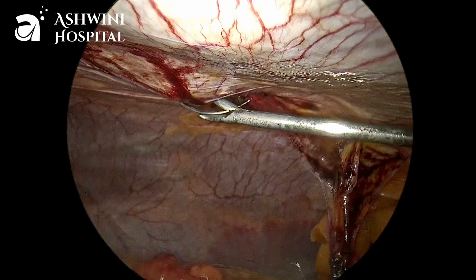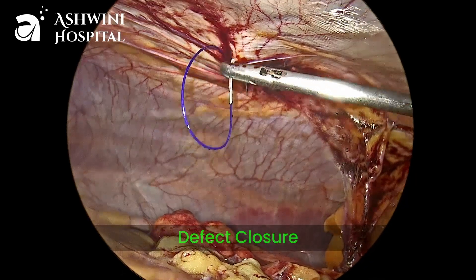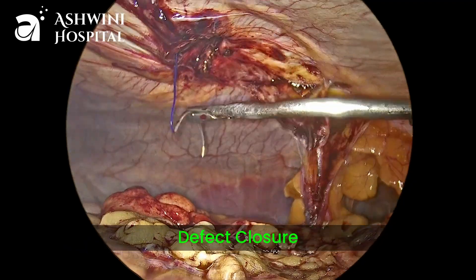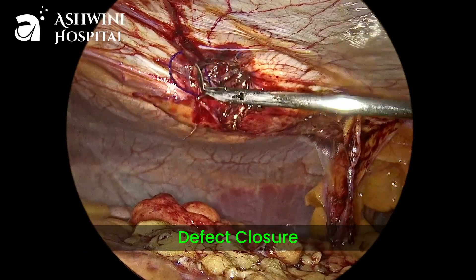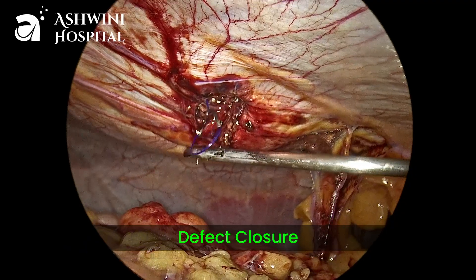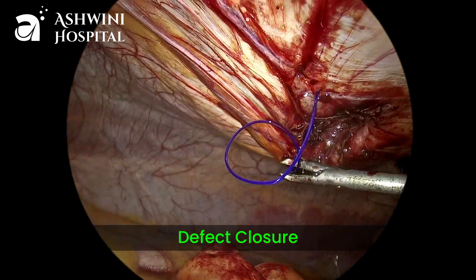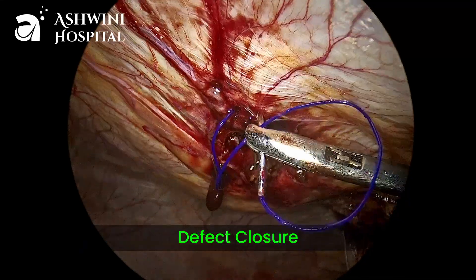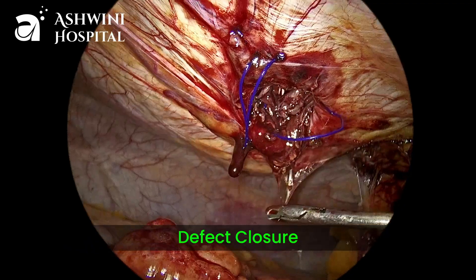Now the defect is closed with non-absorbable sutures. In this case we used 1-0 prolene. We can use barbed sutures or loop nylon also for this purpose. It is better to close the defect instead of leaving it, as this will help in decreasing postoperative seroma formation and recurrence rates will also be less compared to non-closure of the defect.